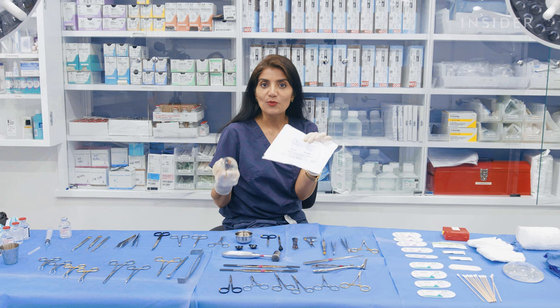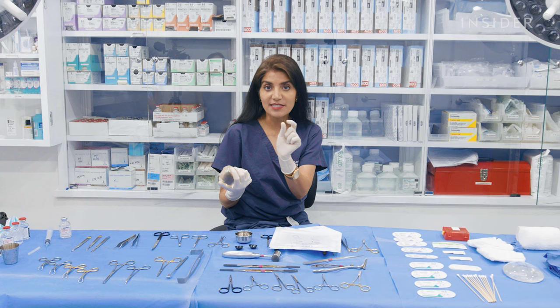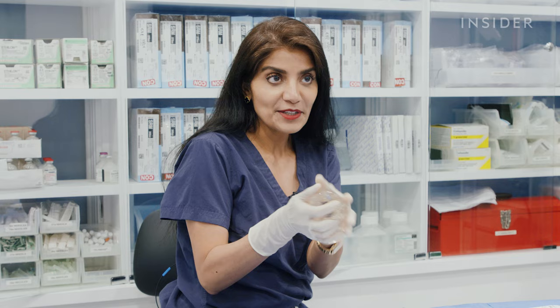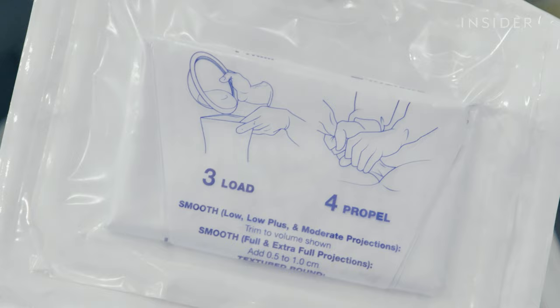We place breast implants with a no-touch technique. So the incision used to place a breast implant is very small. It's about 2 centimeters, so less than an inch. It's placed in the inframammary fold just underneath the breast crease, so right where an underwire sits on a bra. And I use this funnel because it's almost like an icing funnel when you're decorating a cake, and it allows me to propel this implant through a very tiny incision right into the breast.